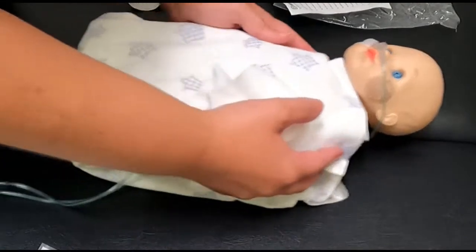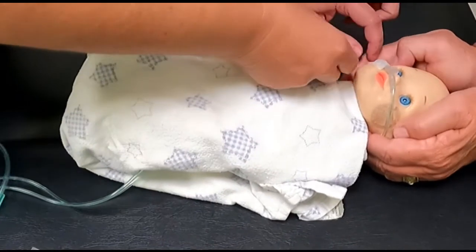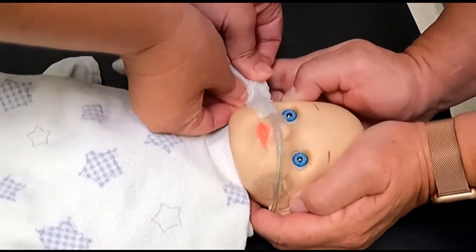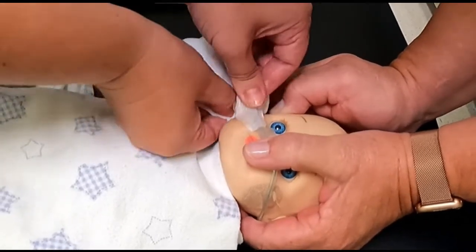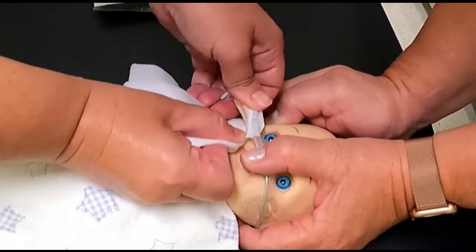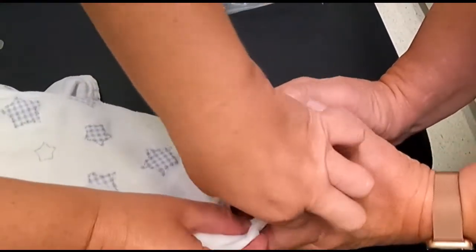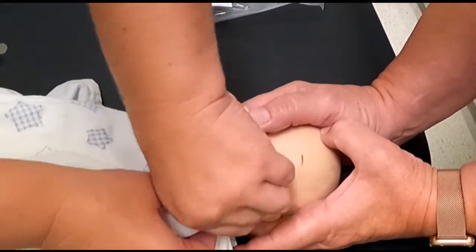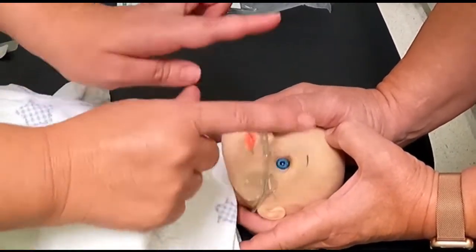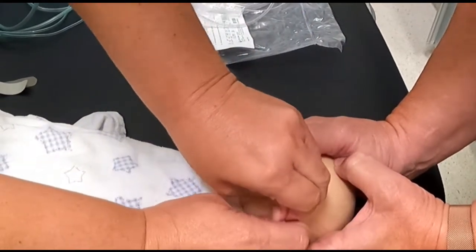So I find I get my helper to stand behind and hold my baby's head. Wrap your baby so you don't have their little hands helping you. And then I just start from the corner, put my flannel underneath, and I gently massage it all off until it's all lifting off. Like I said, the first couple of times can be a little bit daunting. So that's how that one comes off. Now this smaller one comes off a lot more easily because it's a lot smaller. So you wouldn't necessarily have the two different taping options on their face. I'm just showing you both of them as your options. So this one just lifts off as well.